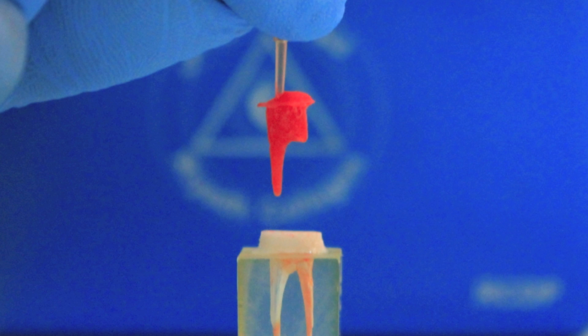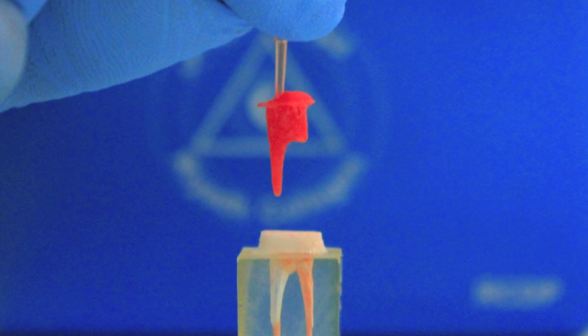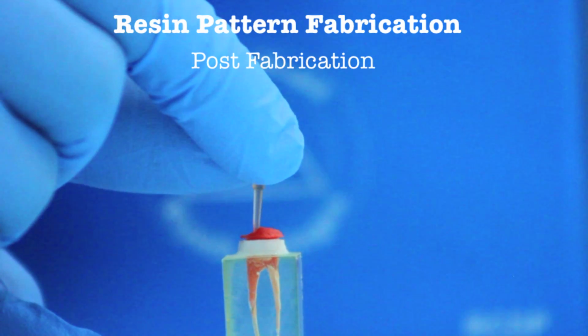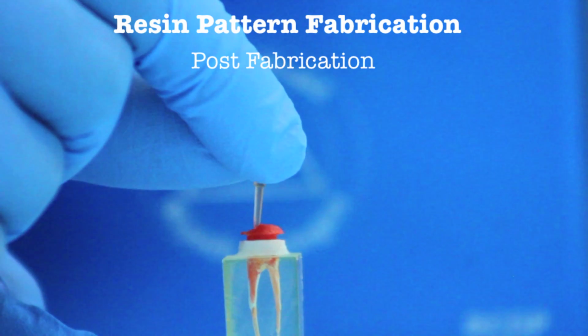As the resin polymerizes, the post is removed from the canal with care taken to ensure that it extends to the apical end of the prepared canal, and it is free of any voids or defects. The post is reinserted into the canal and moved up and down again to make sure it can be withdrawn easily at a later time.